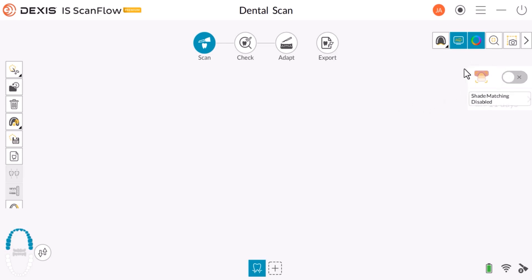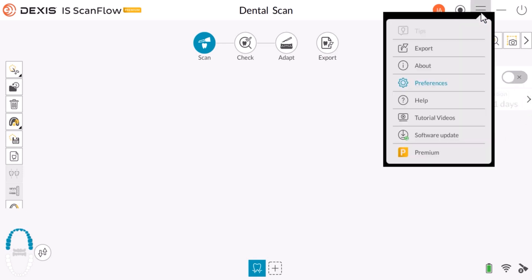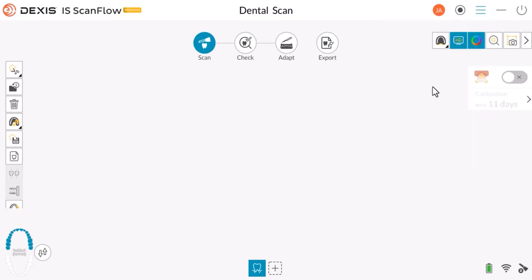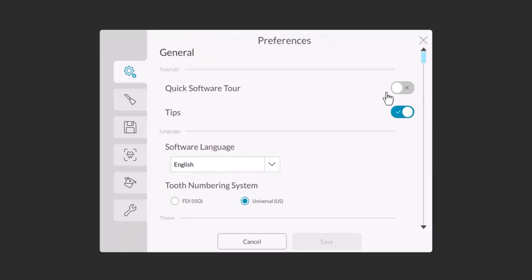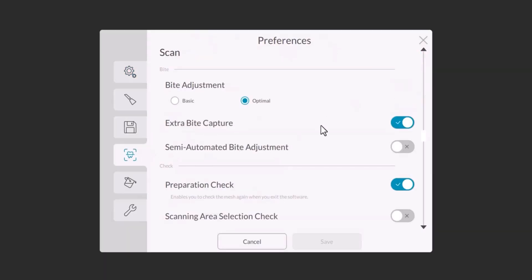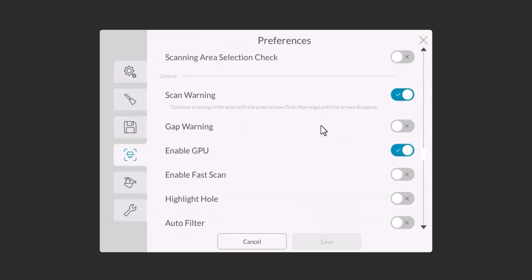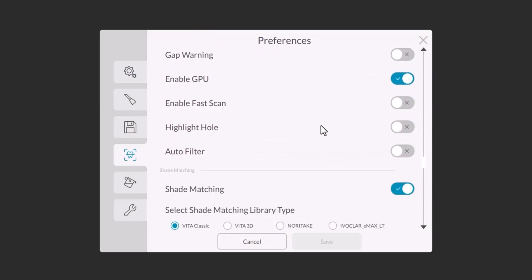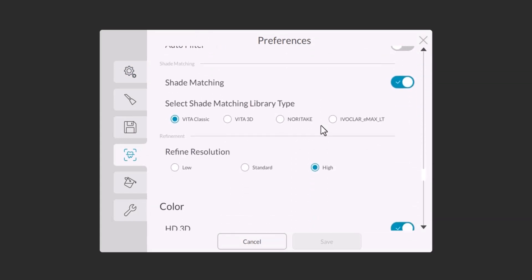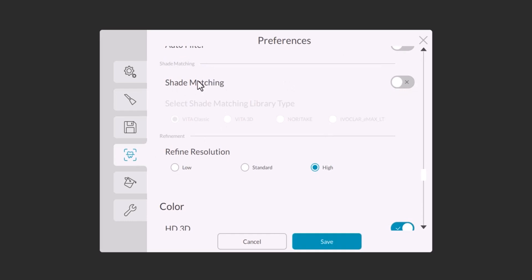If you want this option not to be available at all, click Menu, then Preferences, then the Scan icon. Scroll down to Shade Matching, click Disable, then click Save.